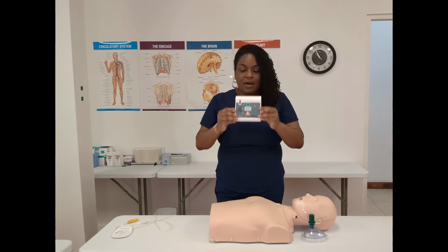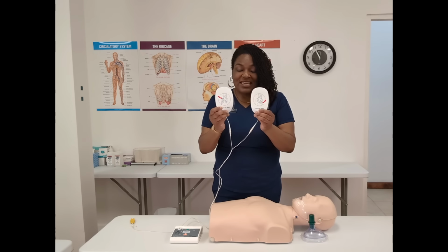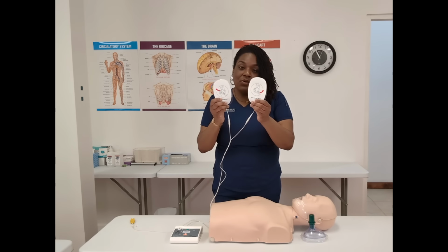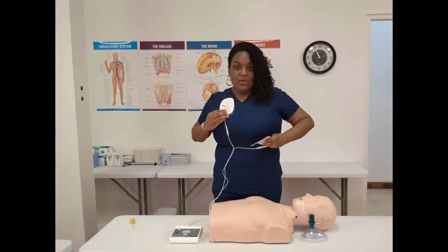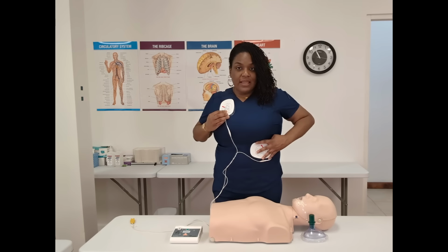We're going to power this on in a few moments. After we power it on, it's going to tell me to apply the pads. And the pads have an image, a diagram on it, which shows you the pad placement. And with an exposed chest, it is high right, low left, okay? So when we say low left, when I talk about the stomach, we're talking about where that crease of the breast would be, because that's where the strongest part of the heart is.